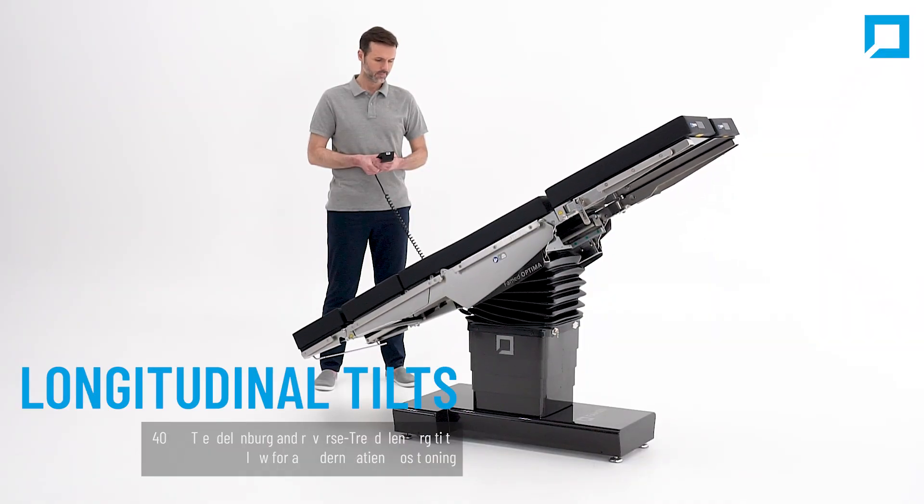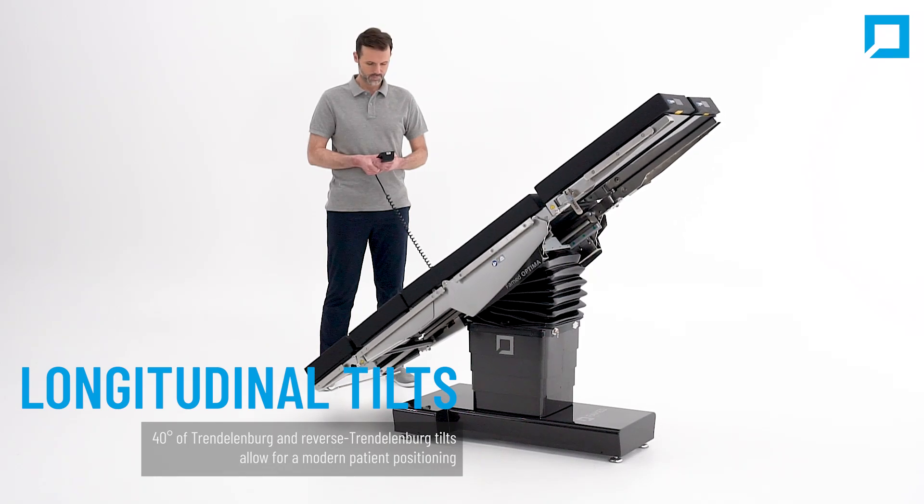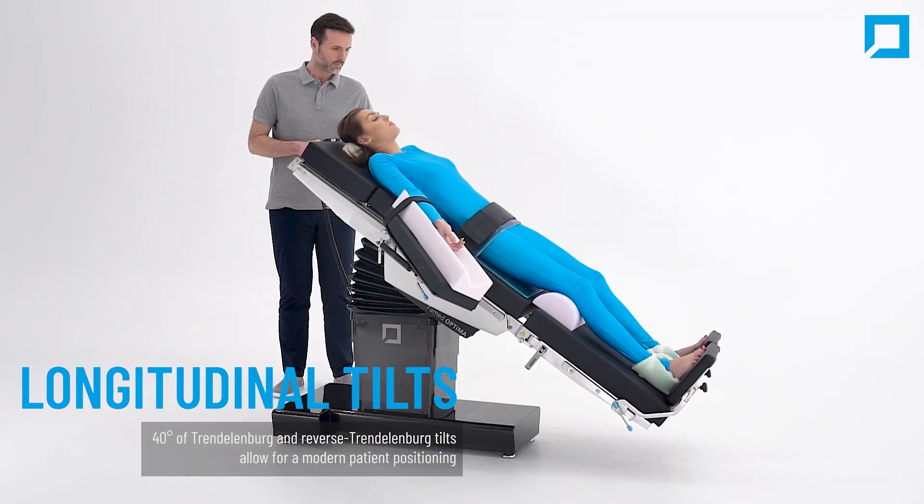Extreme longitudinal tilts: 40 degrees of Trendelenburg and reverse Trendelenburg tilts allow for modern patient positioning.